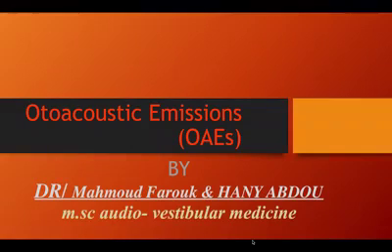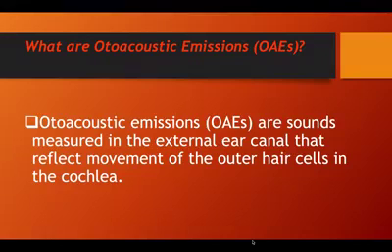Hello everyone, my tutorial today is about otoacoustic emissions. Let's move on. First of all, what are otoacoustic emissions? Otoacoustic emissions are sounds measured in the external ear canal that reflect movement of the outer hair cells in the cochlea.